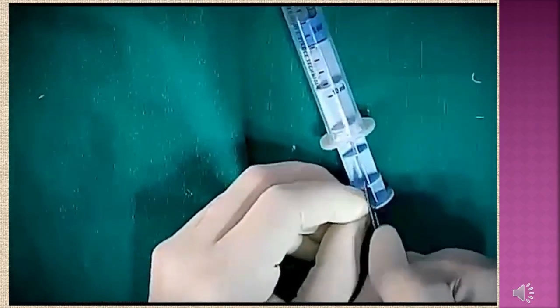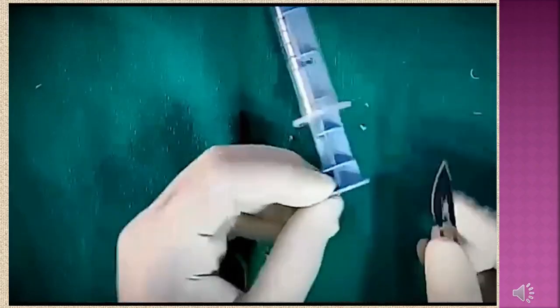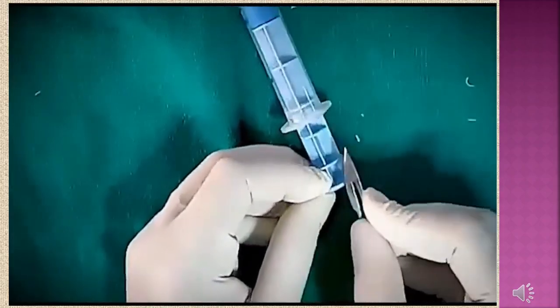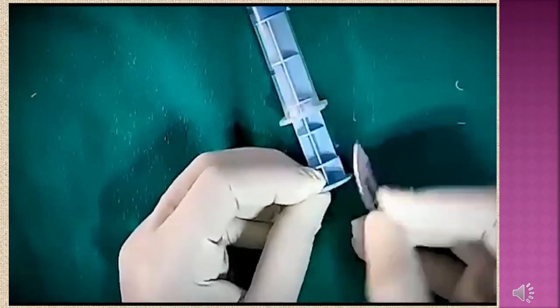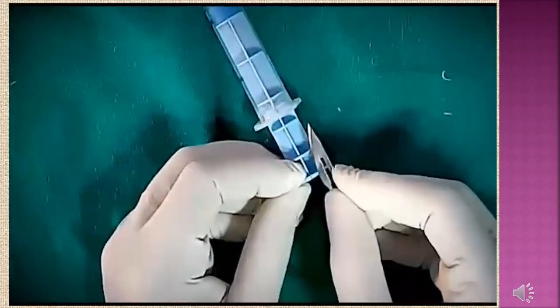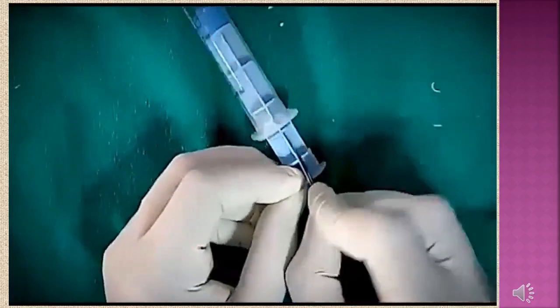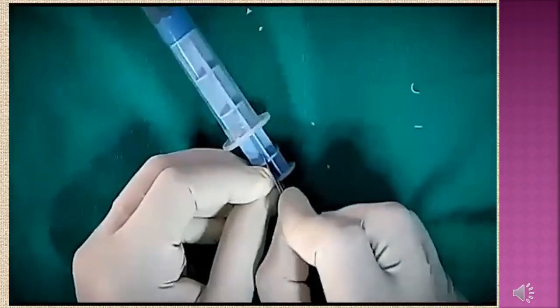The slots have to be symmetrically opposite to each other. While making the slots, you should be cautious that you shouldn't injure your fingers. So this caution should be taken. All aseptic precautions should be taken.